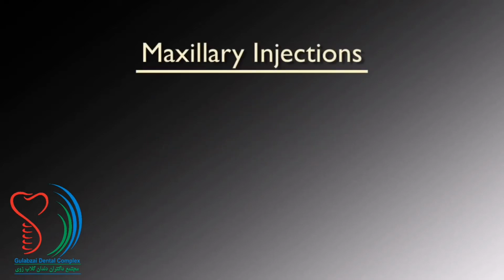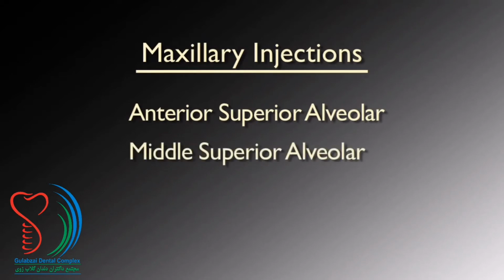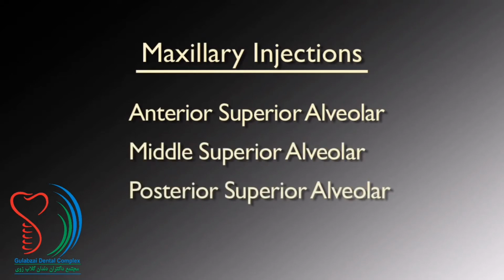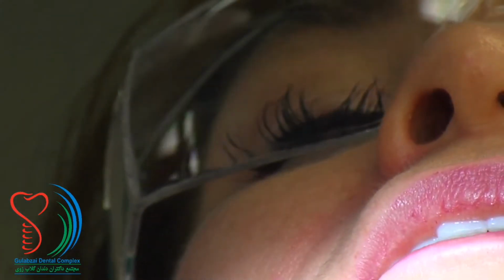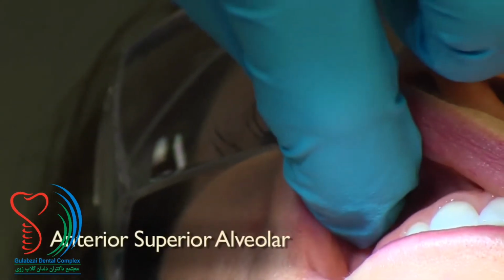The three injections we'll be demonstrating are the anterior superior alveolar, the middle superior alveolar, and the posterior superior alveolar. The first injection we're going to be demonstrating is the anterior superior alveolar.